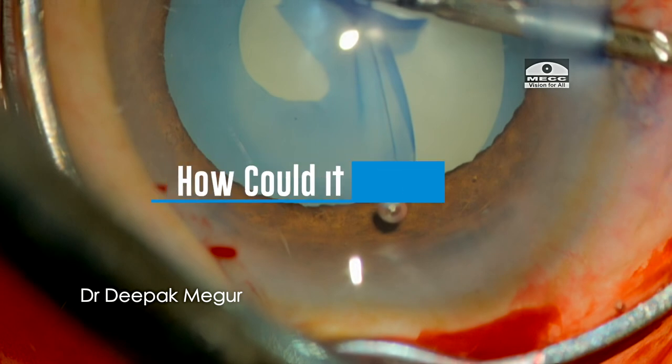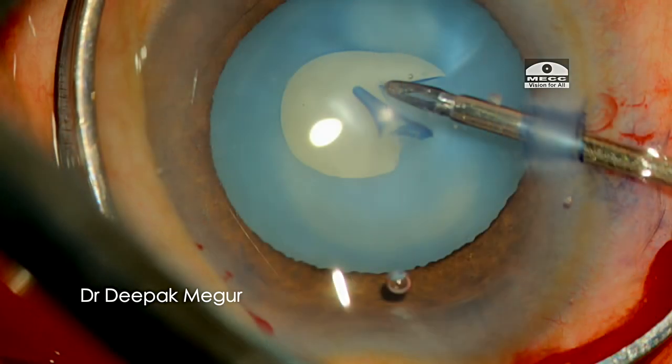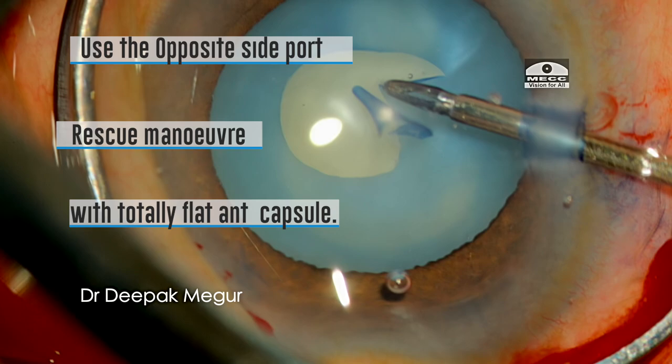I could have avoided this by stopping, going back, and reforming the chamber with OVD to give more time to plan. I should have used the opposite side port to change my angle of attack, and used the micro forceps through that port to ensure the flap would have been much flatter, making the pull and rescue maneuver more effective.